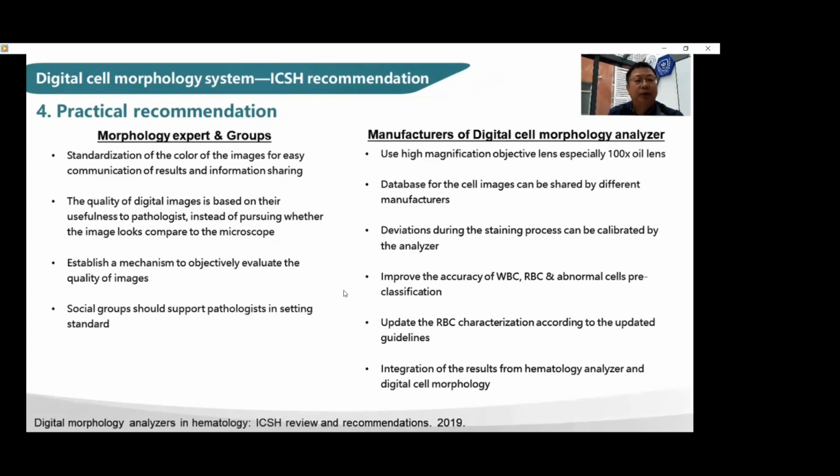And we can also say that from the practical perspective, we made the following recommendations for morphology experts and groups. Standardization of the color of the image for easy communication of results and information sharing. And we should also judge the quality of the digital image based upon its usefulness to the pathologist, instead of pursuing whether the image looks the same as under the microscope or not.